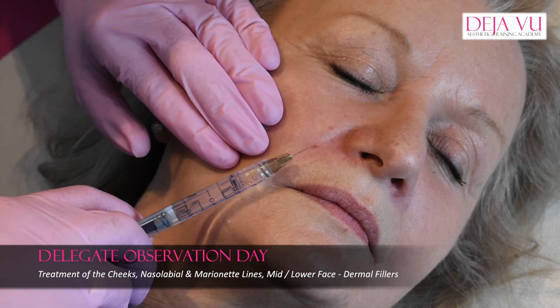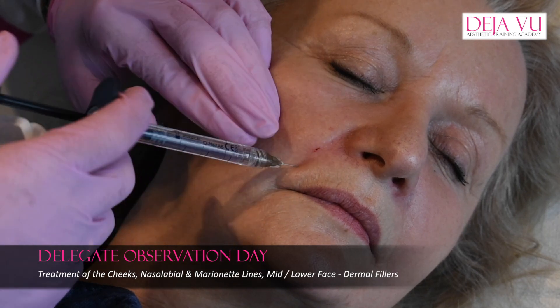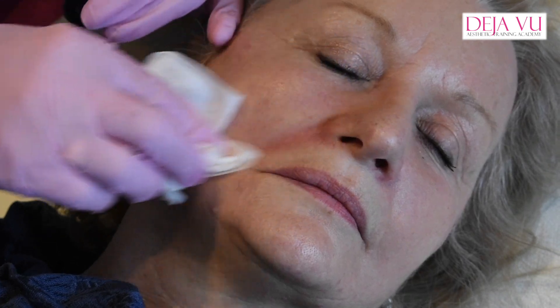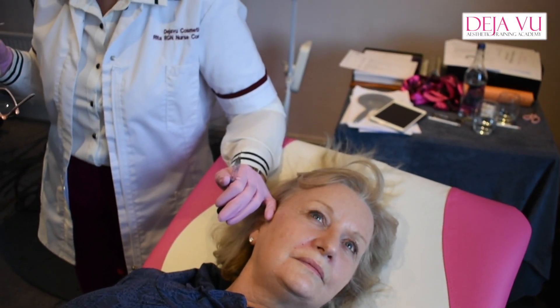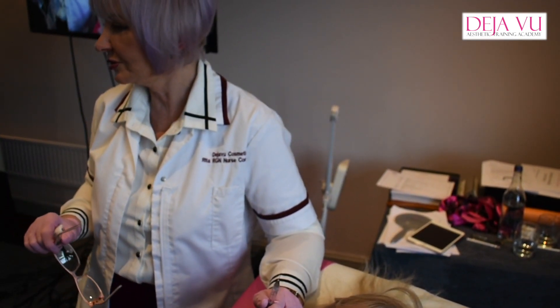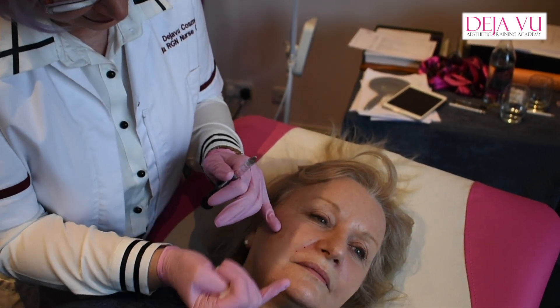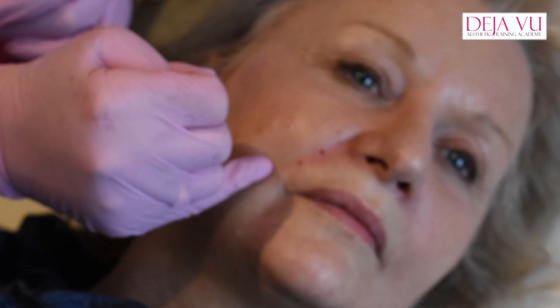Going again at 90, through to the needle, angle it, and in. What you need to start doing now is looking at the anatomy, the facial arteries, and where the angular artery is and all the different ones. It might be a good idea to have a little picture by the side of you. The artery for the mouth — if you put a little finger by the edge of the lip, you know that facial artery is coming in just about there, so you don't want to go deep there.